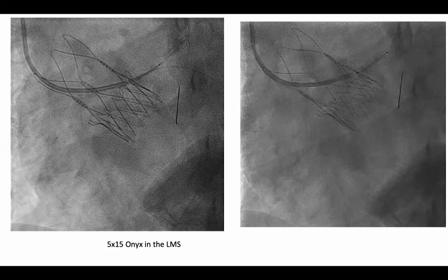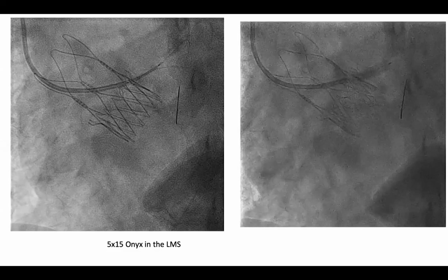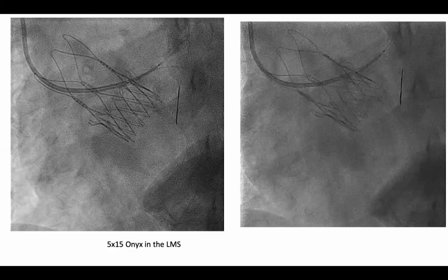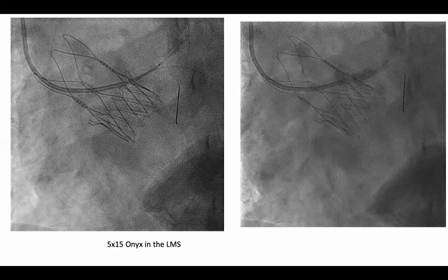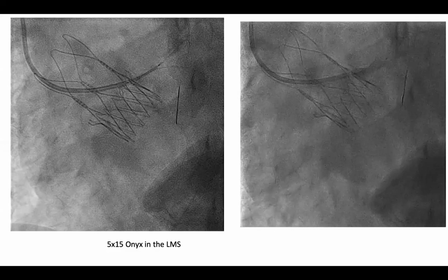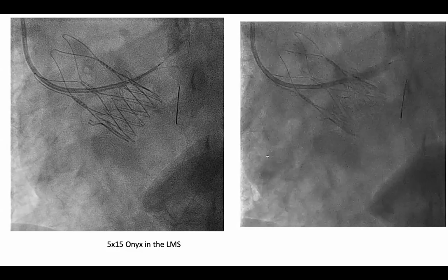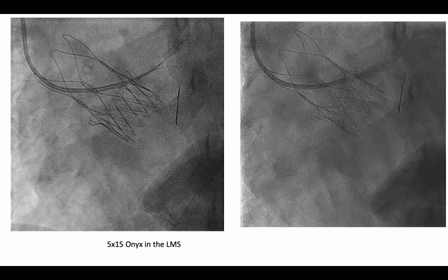Well, actually, coming back to the point that was made earlier, the reason I went up with an Amplatz guide was that I was hoping to fit it into the left coronary system rather than a Judkins left, which is what we eventually used. But as it happened, it sat very nicely in the right coronary artery, allowed me to take a picture of the right, but I could not fit the Amplatz guide into the left, which is why I then switched out to the Judkins left. JL 3.0 or JL 3.5, sometimes they're the best catheters to actually go through.